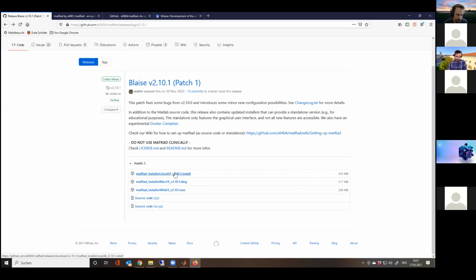For Linux users, I always say, if you use Linux, which is a very good operating system, I also expect you to be able to resolve package dependencies. When you download and install this, I'm sure that all the MATLAB-related software is there, but there might be something missing on the system itself, and you might then need to figure out on your own if you can get it to run. That's probably the most difficult thing.